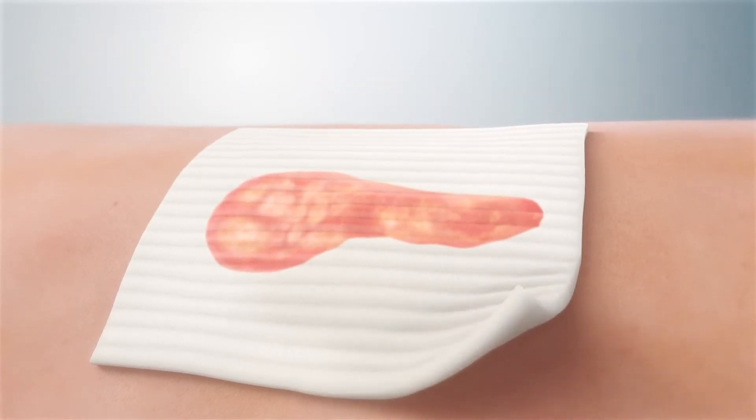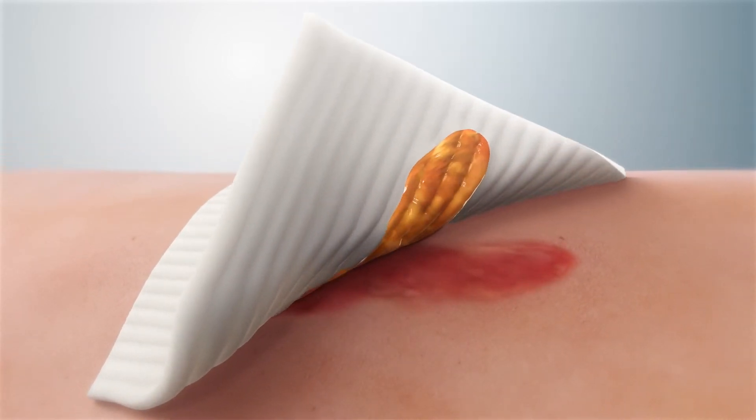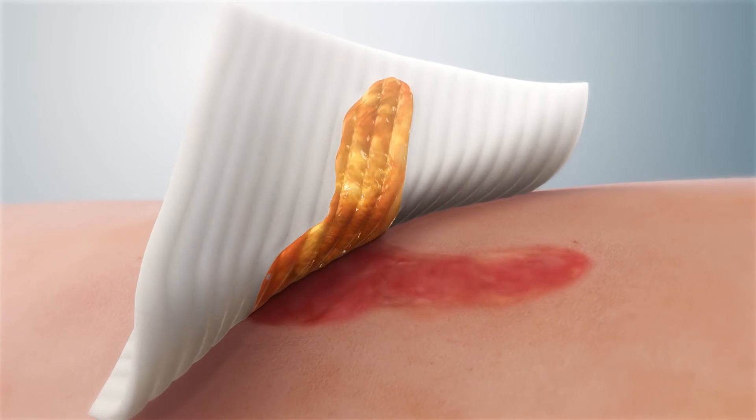Hydrofibre technology aids autolytic debridement, removing the absorbed and loosened sloughy tissue from the patient's wound.